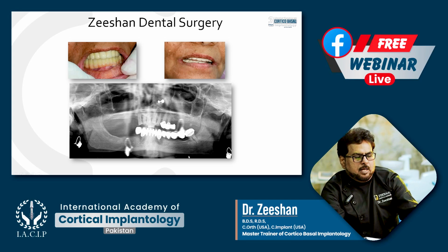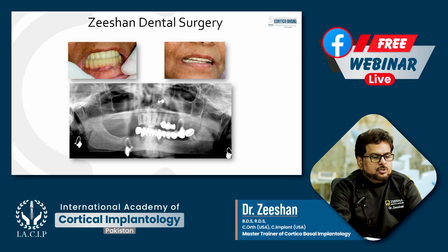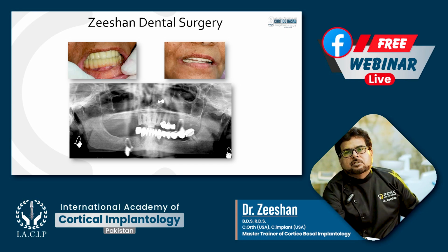So we have to learn how to find the basal bone and how to use it. Why? Because the basal bone is harder, stronger, stiffer than cancellous bone, and it's almost free of infection, and it's almost free of resorption. So we have to learn the way and technique to reach the second cortex.